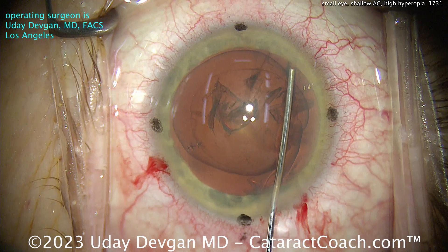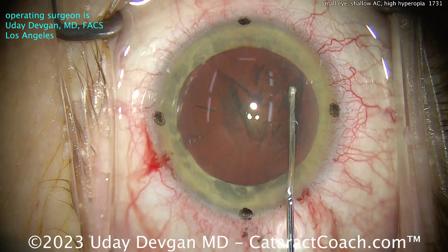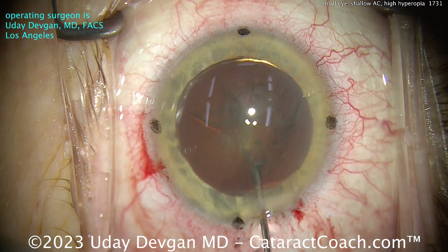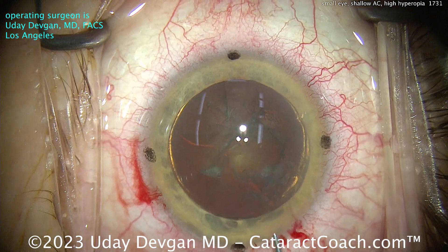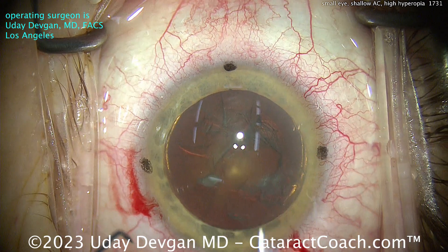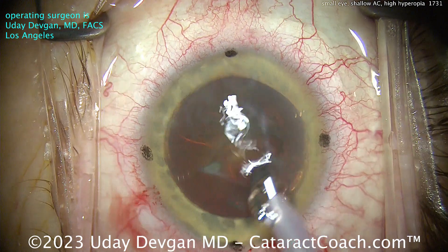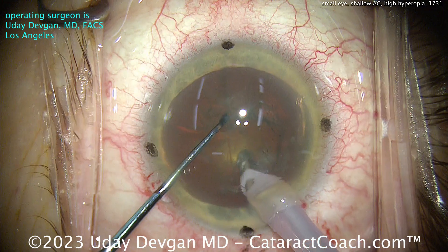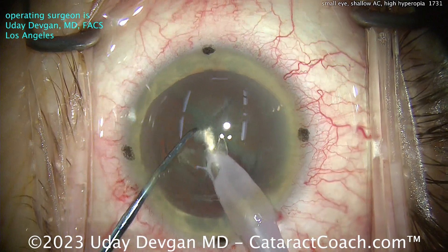In a case like this where the AC is shallow, we're not going to try to prolapse the nucleus out of the bag — it's too big, too chunky, not enough room. Instead, we're going to chop this thing in the bag. There's a little hydrodelineation; you can see the golden ring, and now it spins very nicely. Our phaco settings will be chop mode with a relatively high vacuum to hold the nucleus, and high flow for efficiency. The phaco probe goes in beveled down, buzzing with the phaco probe, chopper going in, splitting that nucleus — very nicely done.